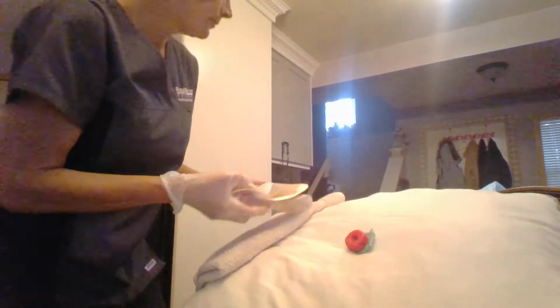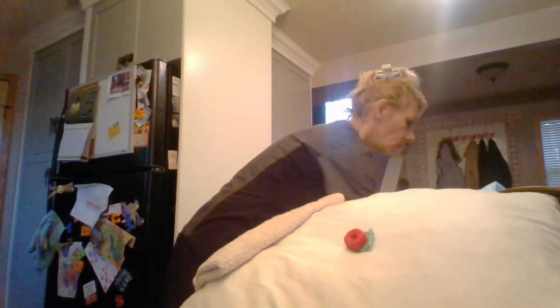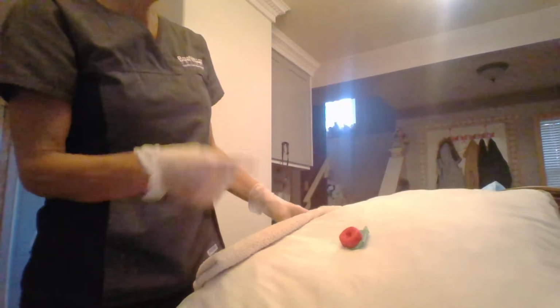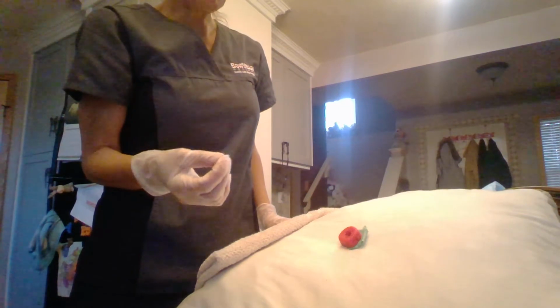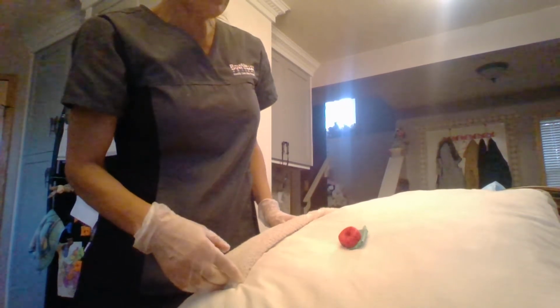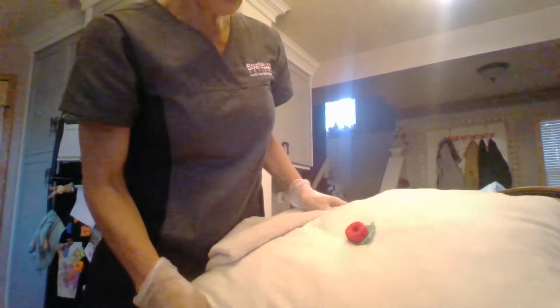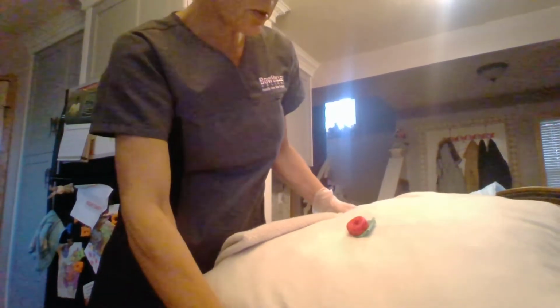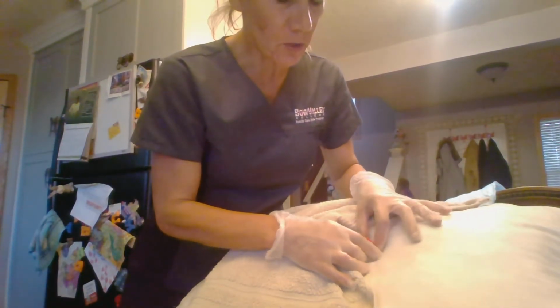Cover the bag. Place the system in your pan or bowl. Cover it with a paper towel. It'll help mask the odors. You could also bring room deodorizer for the room while you're doing this, or maybe even turn the bathroom fan on in the washroom that's there, that would help with the odors in the room. Place the towel around in your area just in case you have leakage from the stoma.